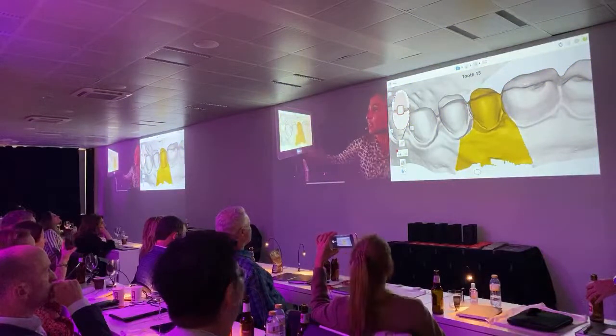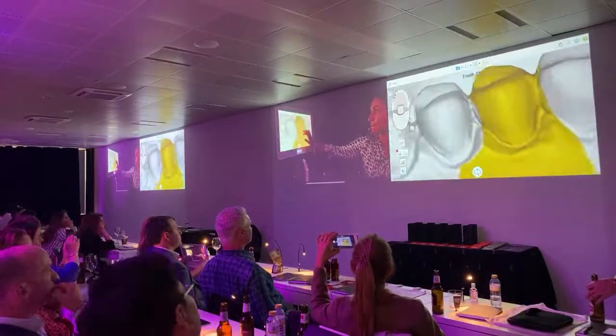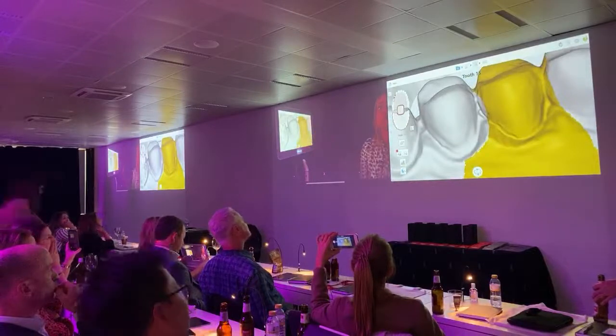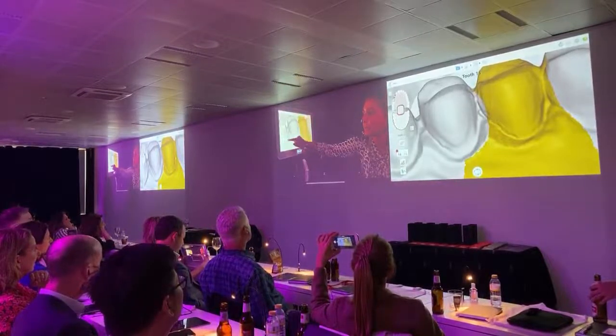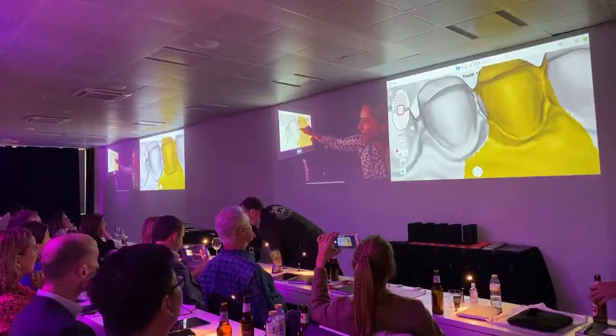Let me emphasize, this is probably one of the most important steps here, okay? We were not doing this, we were messing up all our cases, okay? Now I'm gonna add only in the 14. So I am in the plus here, and then I just come here, and you close the circle.